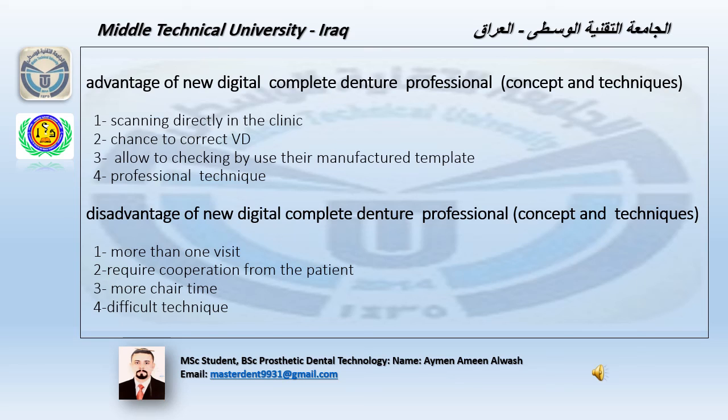Advantages of the new digital complete denture professional concept and technique. Number 1, scanning directly in the clinic. Number 2, chance to correct the vertical dimension. Number 3, allows checking by using the manufactured template. Number 4, professional technique. And the disadvantages of the new digital complete denture professional concept and technique.